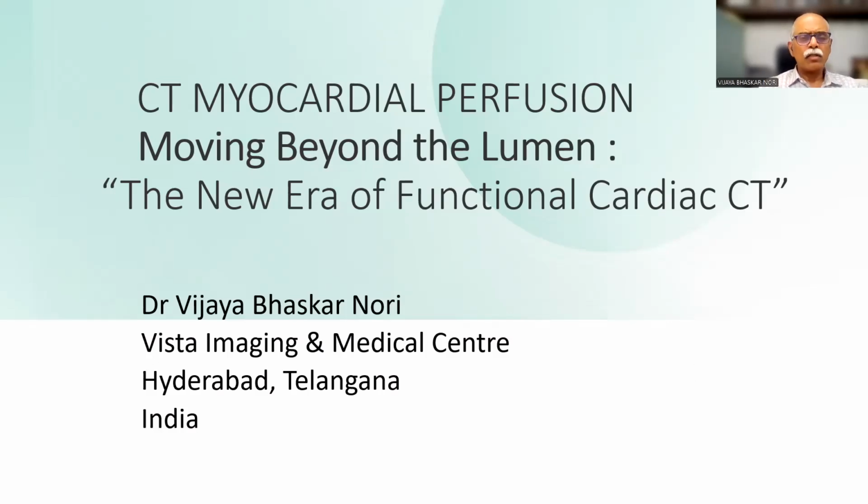I'm a cardiac radiologist. Today, I would be bringing you my experience on CT myocardial perfusion, which is one of the latest tools in the armamentarium of CT coronary angiography. We have to understand that the imaging of coronary artery disease is moving beyond the lumen. The new era of functional cardiac CT has started. The imaging of ischemia is now playing a paramount role.